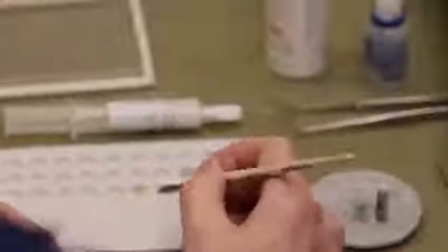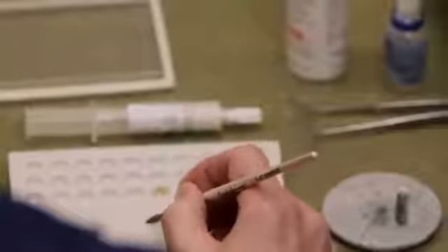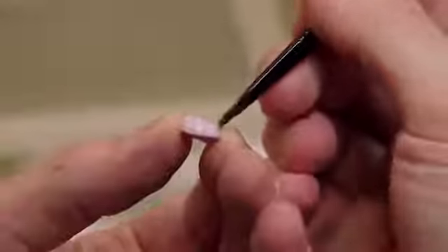So we have some glaze here, and we have to slightly dilute it with this liquid, just a tiny bit. We characterize the occlusal with stain to give it a third dimension, to make it not look flat, not to put in stains, and just characterize the gingival third. If you can see it, it's almost too much. And this is going to give us our gradation of color that we need. And for the occlusal, all I do is run a little bit of stain through the isthmus, again, so you can barely see it. It shows that there's a slight bit of a dimension there.